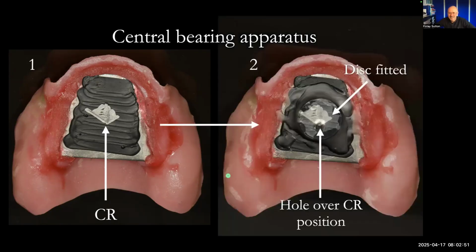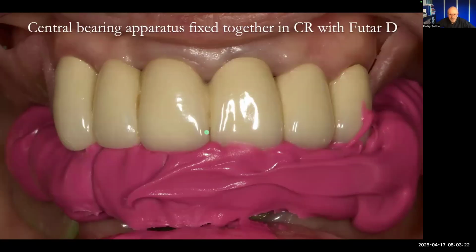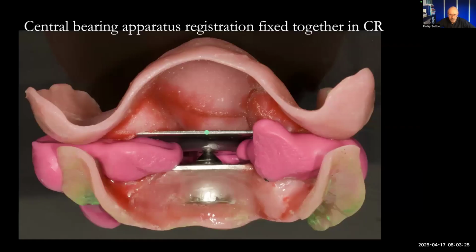And then on top of that, I fix a disc which has a hole in it, a little countersink hole right over the tip of that triangle. I stick it on with some wax and a wax knife. And then that goes to the mouth. I just get her to bite together into that so that the stylus here goes straight into that hole, and then she's held in that position, and then I can inject Futar D into that, and I've got a fantastic bite record. Just take that out of the mouth. Look at that. That is so locked in. It's fantastic.